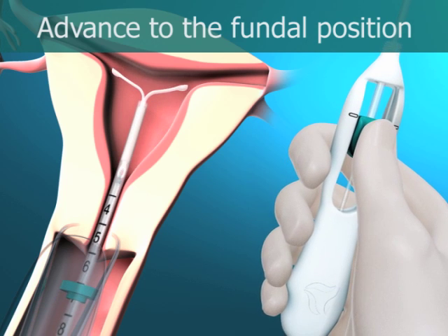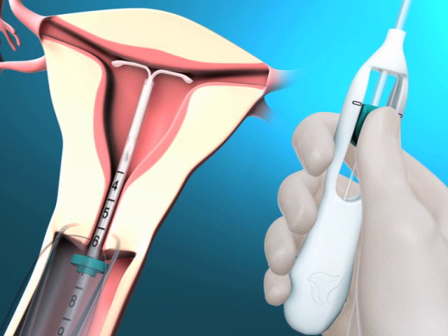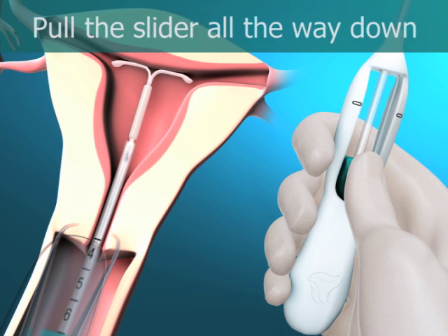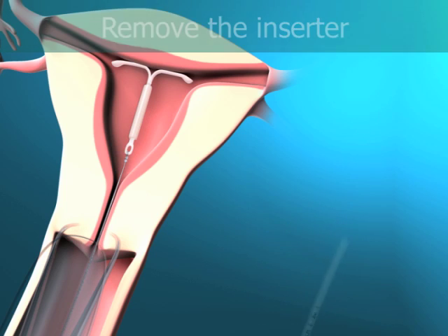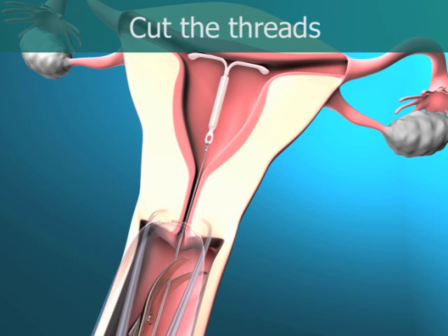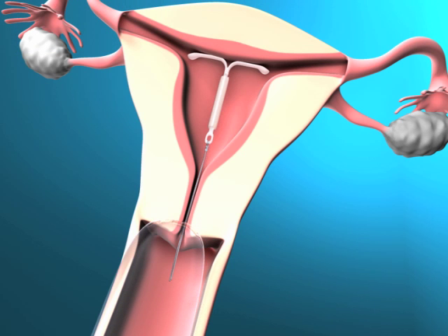Advance the inserter gently towards the fundus of the uterus until the flange touches the cervix. Mirena is now in the fundal position. Hold the inserter in place and release Mirena by pulling the slider all the way down. While holding the slider all the way down, gently remove the inserter by pulling it out. Cut the threads to leave about 2 to 3 cm visible outside of the cervix. Mirena insertion is now completed.